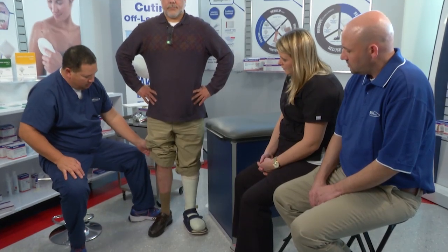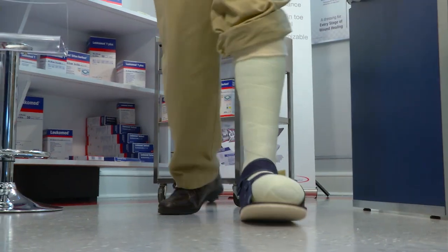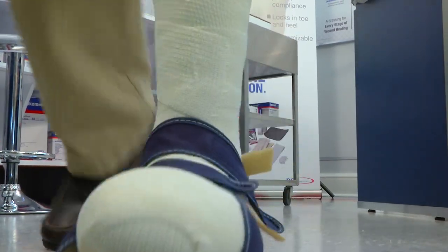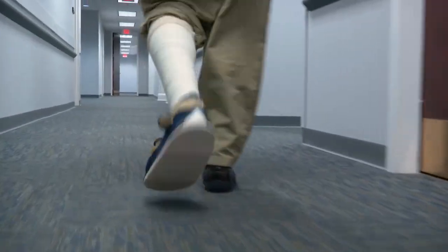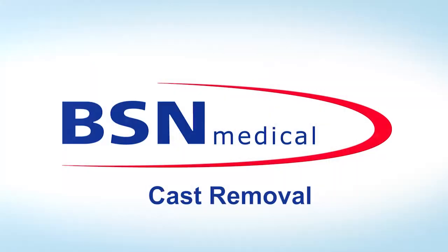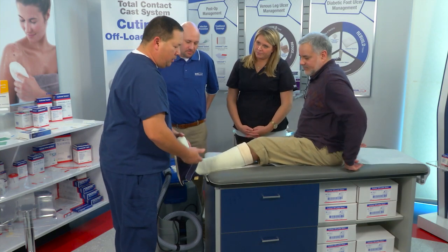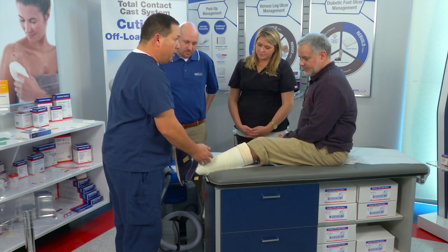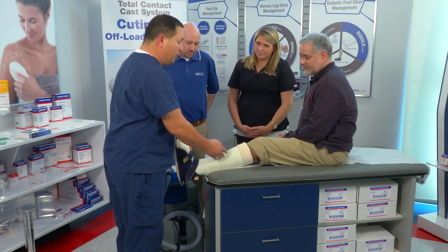Let's have the patient take a walk. After the patient returns to the clinic, the first initial cast goes on for three days. After that, if they seem to tolerate it okay, we'll come back on a weekly basis.